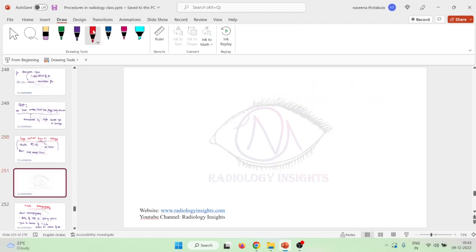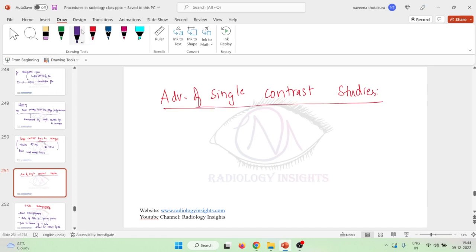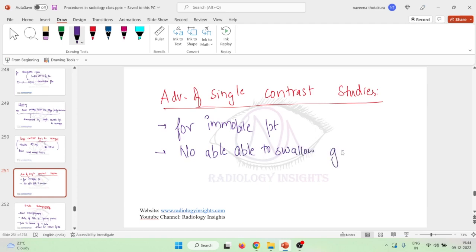Okay, next. What are the advantages of single contrast studies? The main advantage is that single contrast study is mainly good for immobile patients or for patients who are not able to swallow gas tablets. Because in double contrast technique we should ask the patient to take gas forming tablets. So if the patient is not able to swallow gas forming tablets, or if the patient is immobile, in them we can use this single contrast technique.